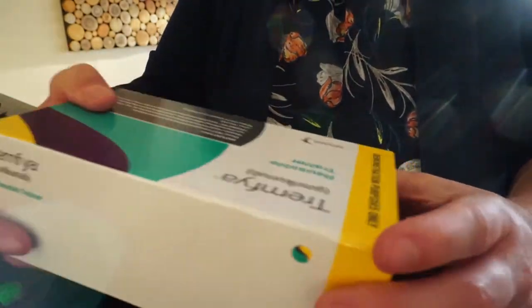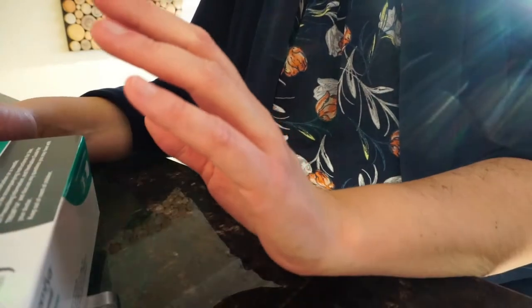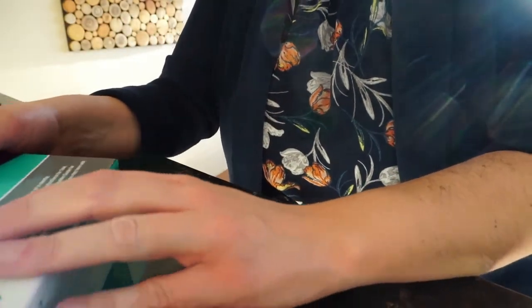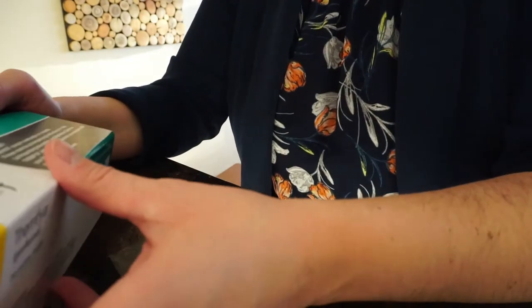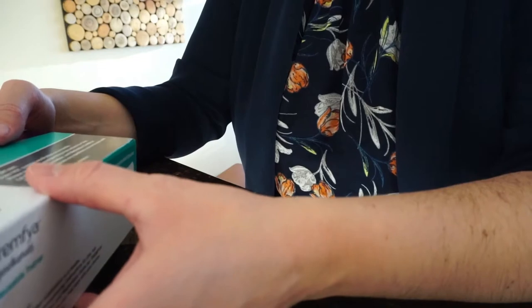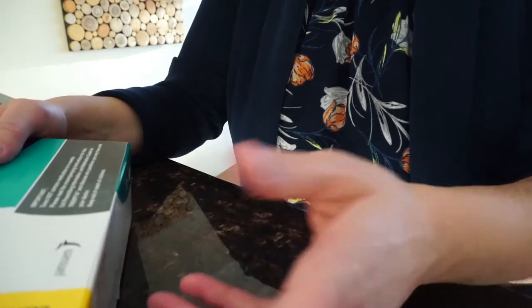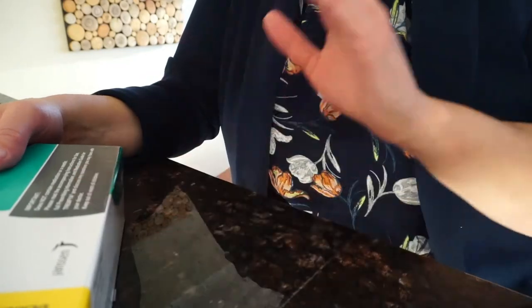After that, it's very important to look at the box and make sure the medication is not expired. If you are having an infection, you probably shouldn't inject — but always defer to your physician, whether that's your rheumatologist or dermatologist. So let's say everything's good.